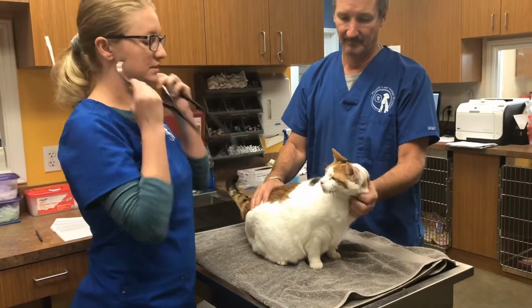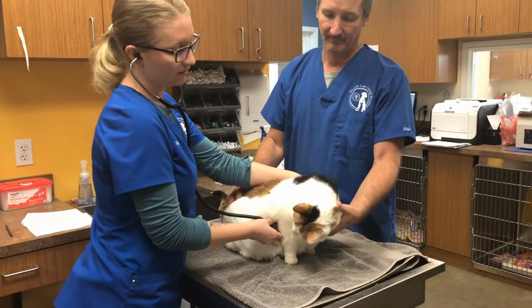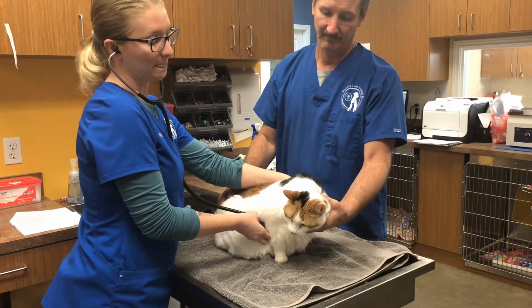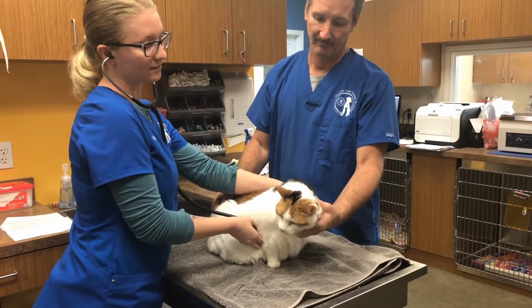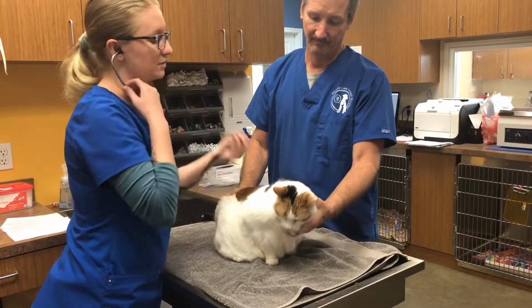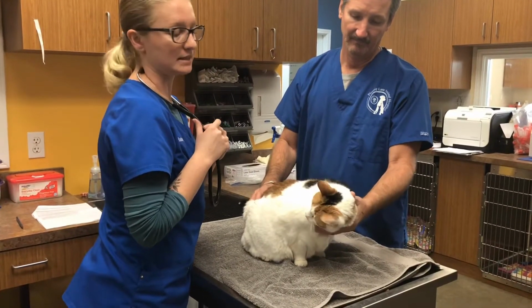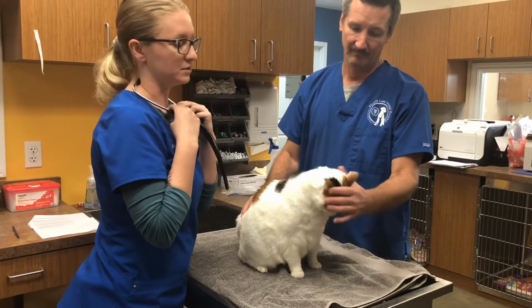So we'll get her pulse now. We'll auscultate her heart. And I'll watch my clock over there. So her heart beat 20 times in 10 seconds. So if I multiply that by 6, then I'll get a heart rate of 120 BPM, or 120 beats per minute, which is normal for a cat.